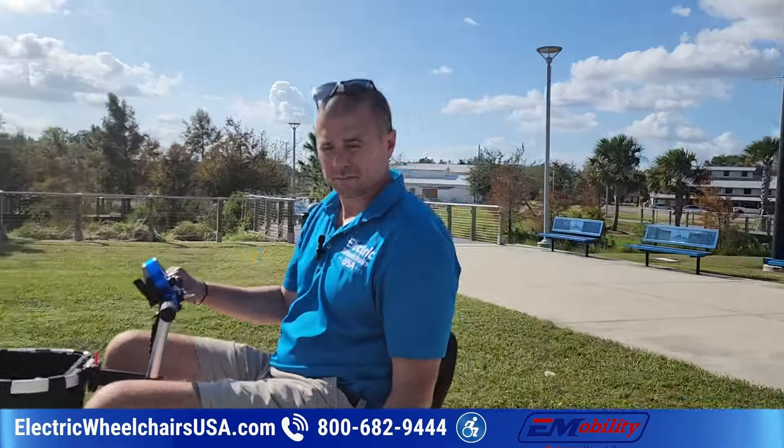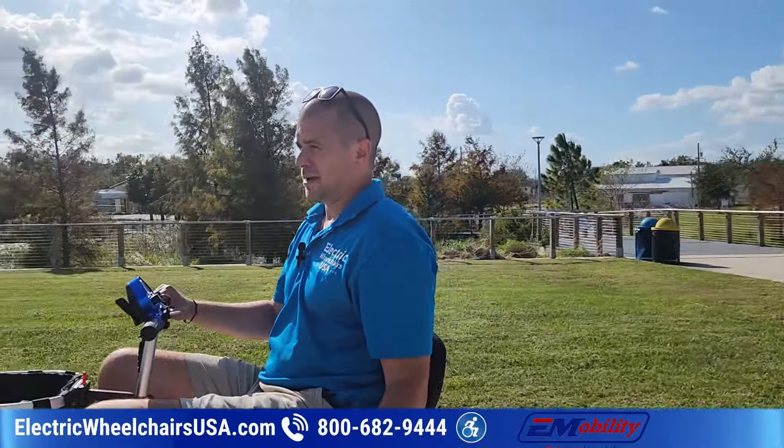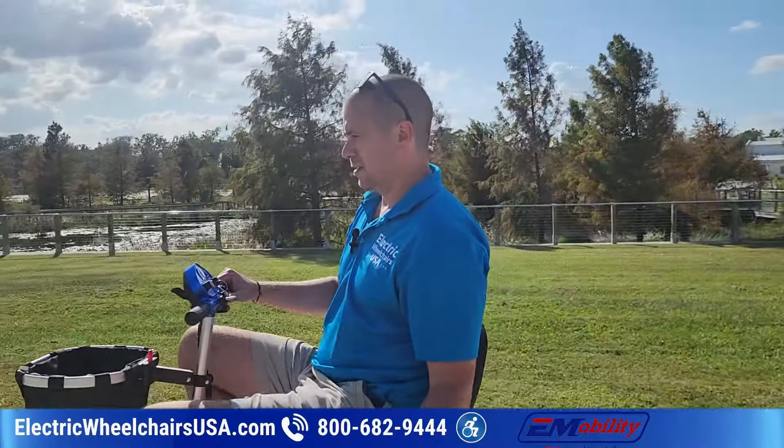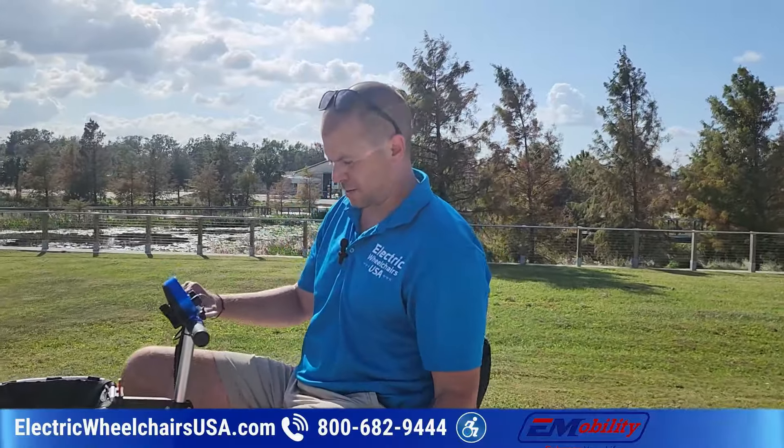I like doing these kinds of videos because a lot of times people buy these scooters and don't get to see them in person. I'm a tall rider, so it helps put things in perspective.